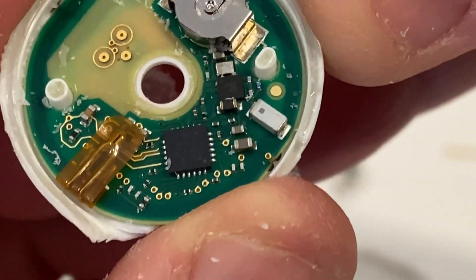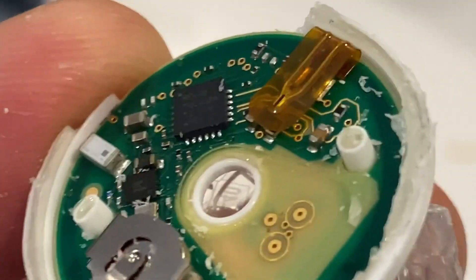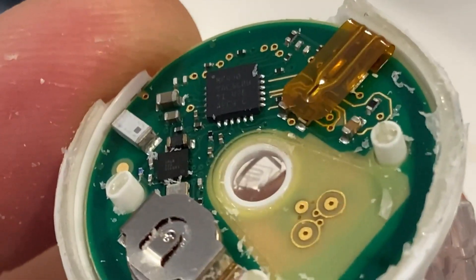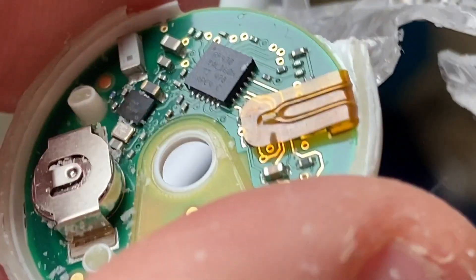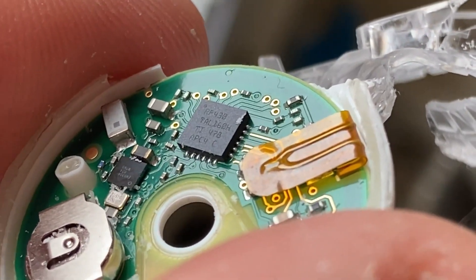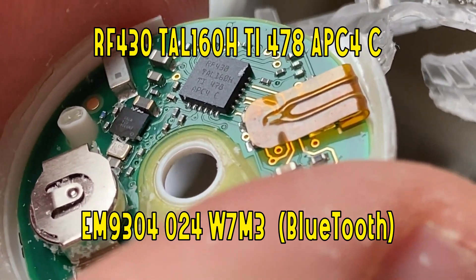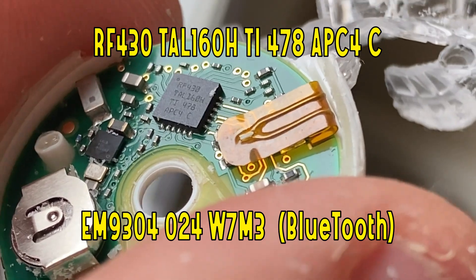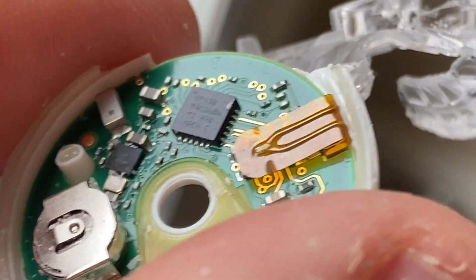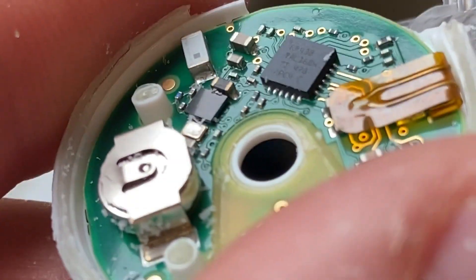I think we got it at the right angle. I see something — RF 430 TAL 160H TI 478 APC4C. So that might be the RF chip, I'm assuming Texas Instruments. I'm going to put a link or at least the description in the video if we can figure out what that chip is. And then below it there's another really tiny one but I can't make out what it says.